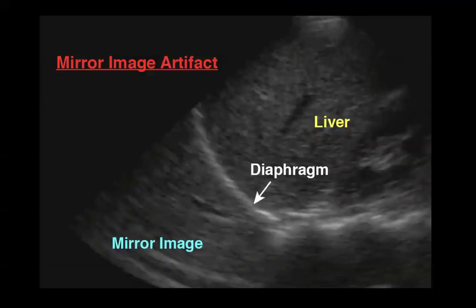In the normal patient, like we were talking about, spines do not extend past the diaphragm because of normal air-filled lung. Think of air as kind of like the enemy of ultrasound. Ultrasound waves can't penetrate all the way through the air and highlight the spines that are actually present here. And because the diaphragm is so curved, there is what's called the mirror image artifact.